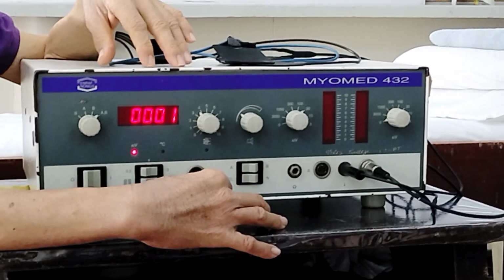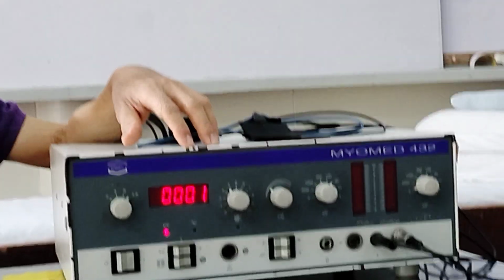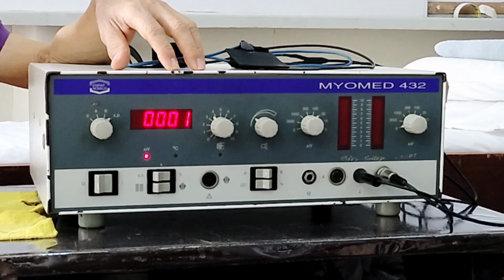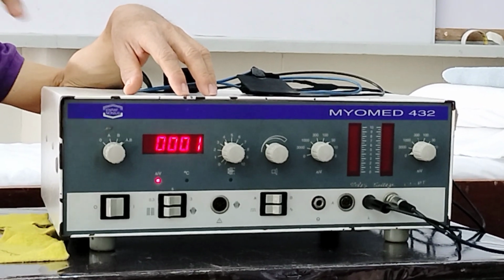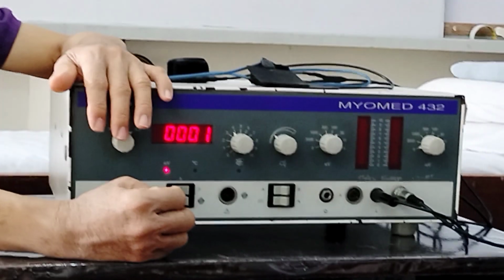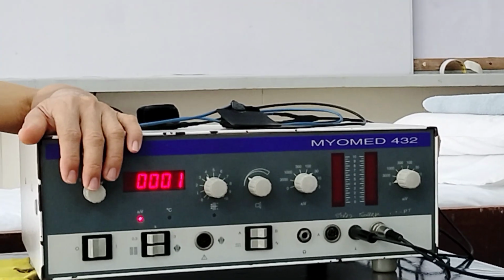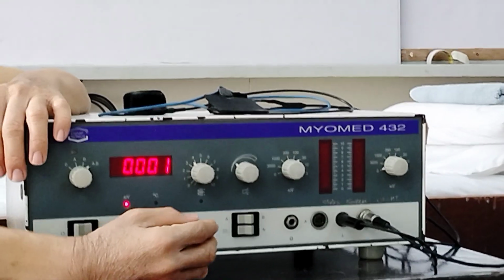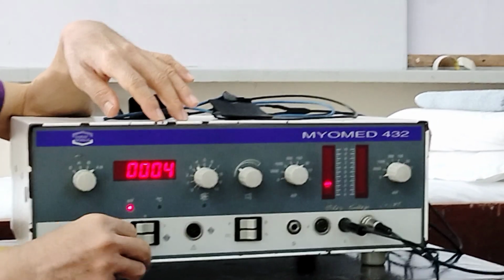This display is more of an oscilloscope display, where you can see the signal move as the muscle contracts. It's like the heart monitors in movies where we check if the patient is still alive, showing the heart rhythm. But we don't have that monitor, so we stay with the bar display.